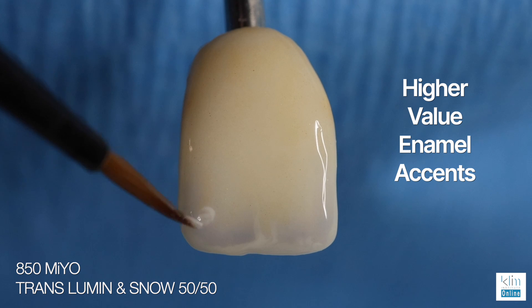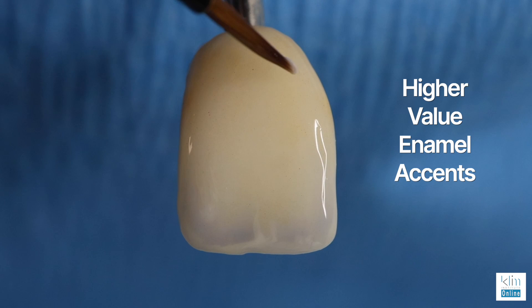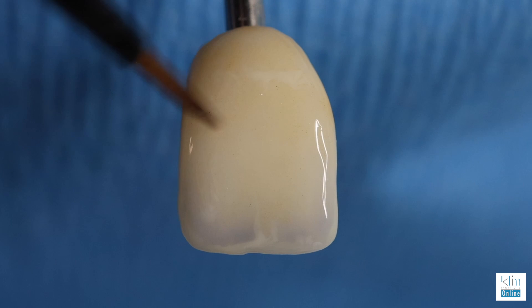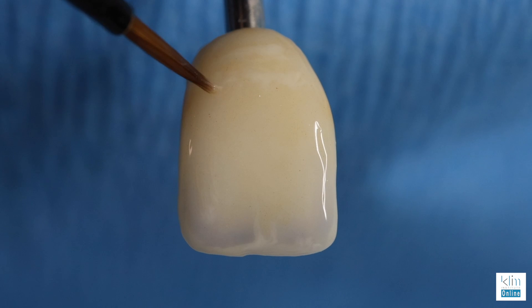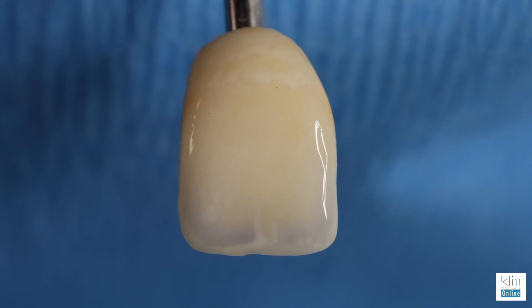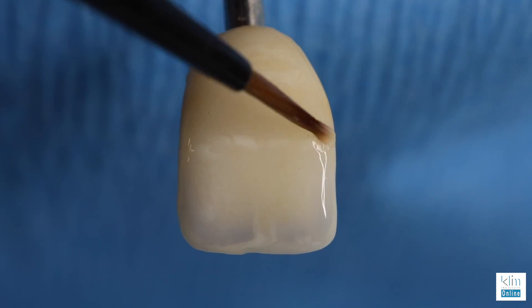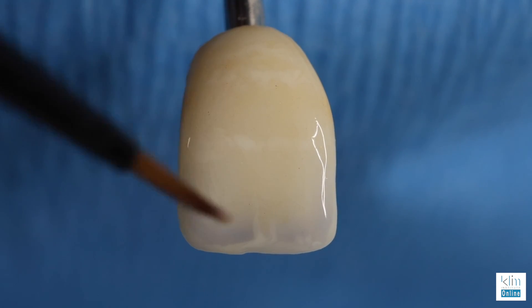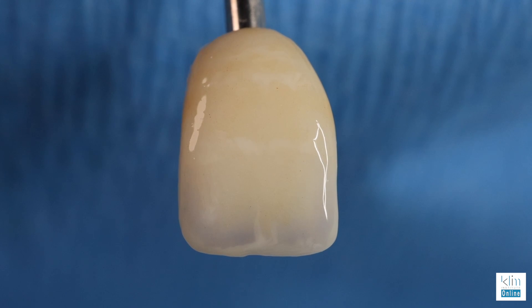Higher valued enamel accents — again, we go back to our lumen and snow 50/50 mix and add those into the surface. This is the last step I take before the restoration is fired. In the area of the perikymata, you often will see a little more high value enamel effects. This material is so easy to apply to your color palette and blend accordingly as the case demands. I often have a photograph of the adjacent tooth so I can paint this in, duplicate what I see, and establish this effect with one coloring. That's why I love Mio so much. Voilà — we're now ready to fire.